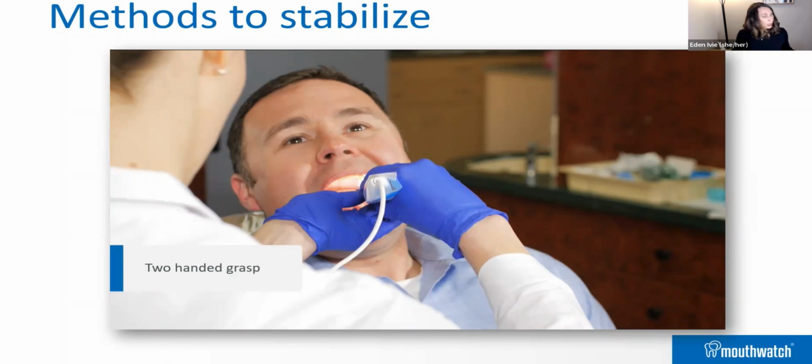Two-handed grasp. Don't be afraid to get creative with your grips on your camera. I really like to hold my camera in two hands and also use that second hand to fulcrum extraorally on my patient. Actually, I'm going to stand up. I have my Typodont here, and I can demo some of these techniques while we look at these images. Sometimes it's helpful to see it in real life here.